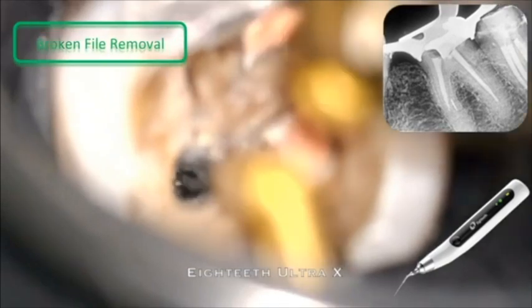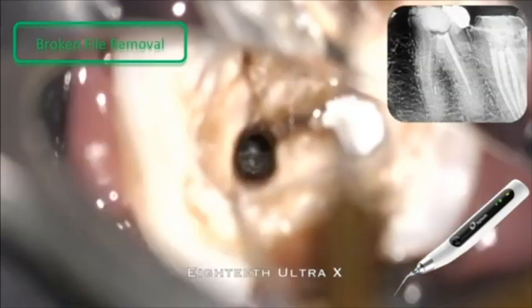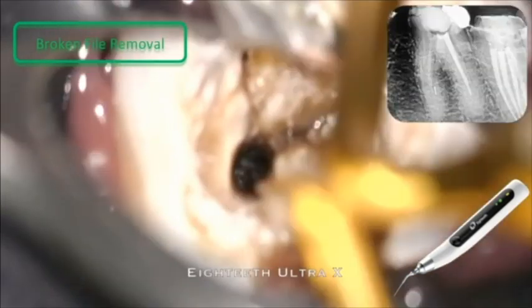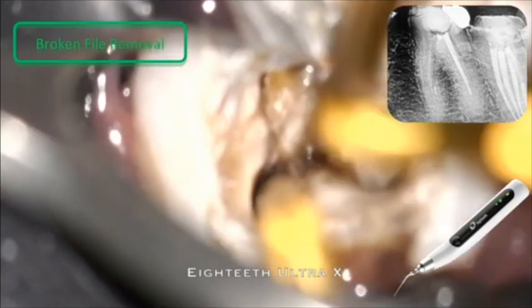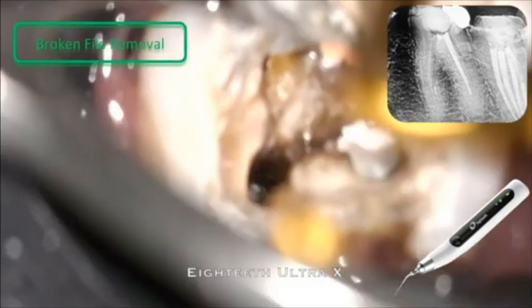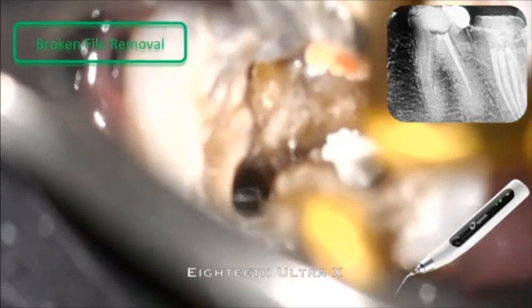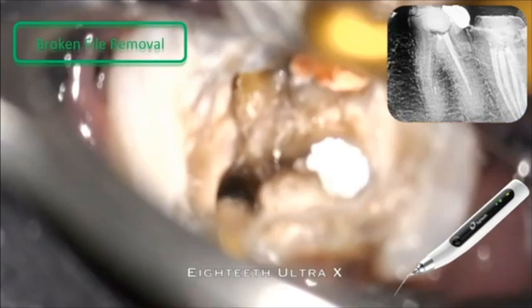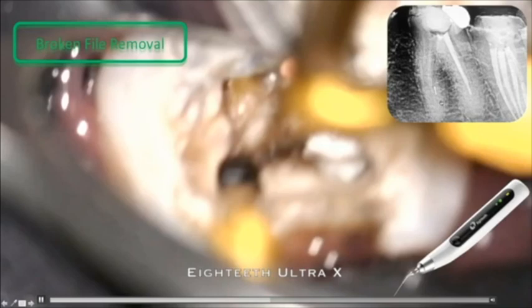On the inner wall, I'm removing substance. I'm vibrating a little bit, and I switch to the Satelec 8025, and because I heated it a lot, it broke. Here I have a separated instrument, as I told you before. The instrument separated because it was overheated, and you can see on the X-ray that the file is shorter now than at the beginning.